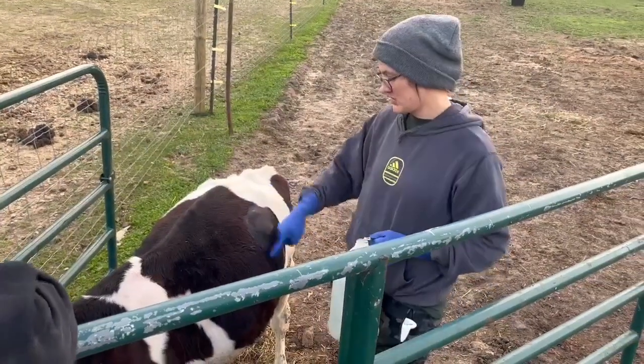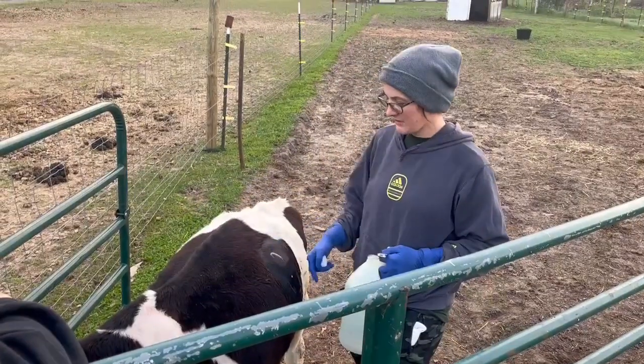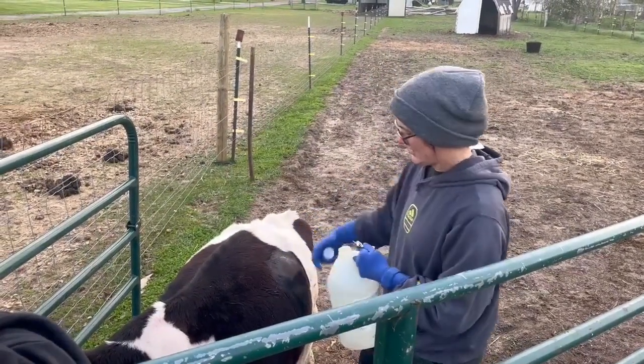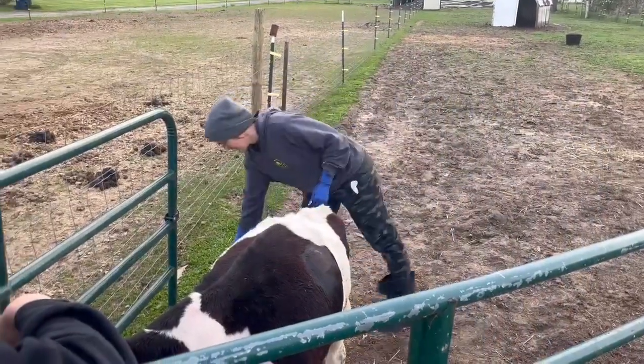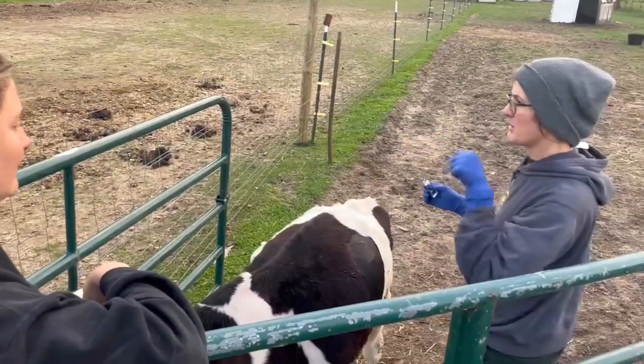This is a bloated calf — it's huge on this side and this side is also big. We clipped it, we numbed it, it's got surgery scrub on it. So what we're gonna do now is cut the skin. Watch them deflate — I'm gonna cut the skin with this and then we poke that through.